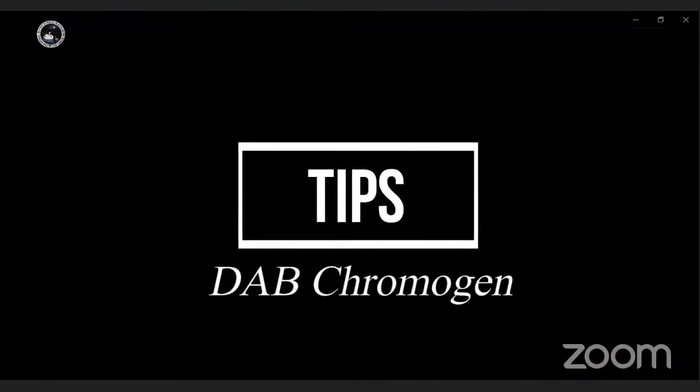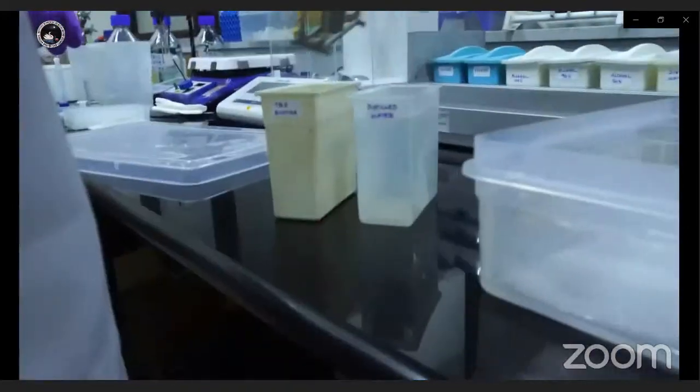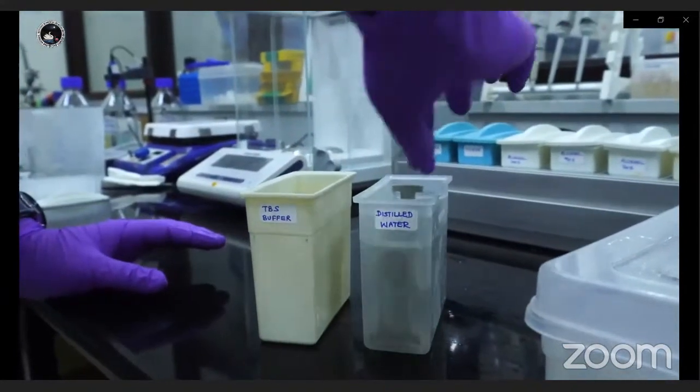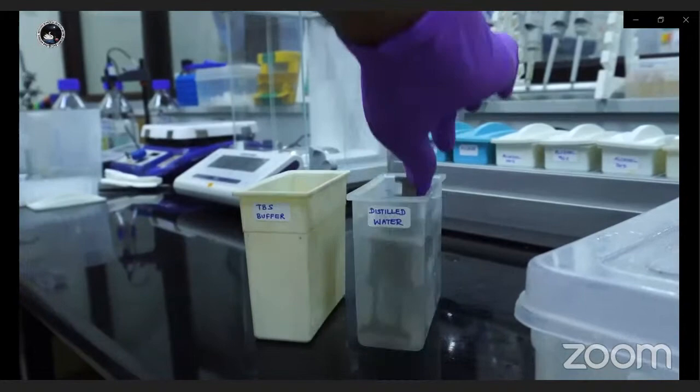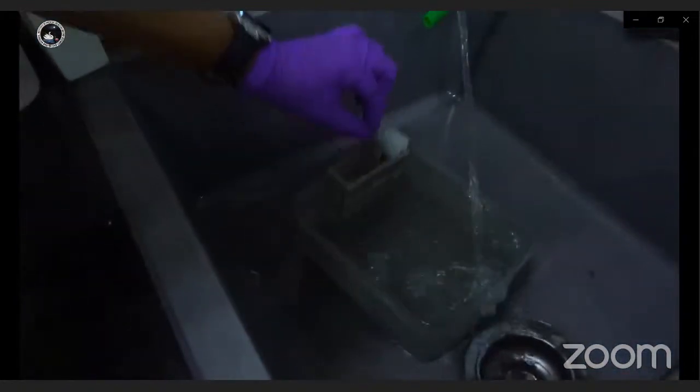When you make DAB chromogen, prepare the solution in a dark vial and incubate in a dark chamber because DAB reacts with light and precipitate may be formed on the sections. Here we are showing it in the light for video purpose. Now wash slides in TBS followed by distilled water to stop the reaction. Place the slides in running tap water.